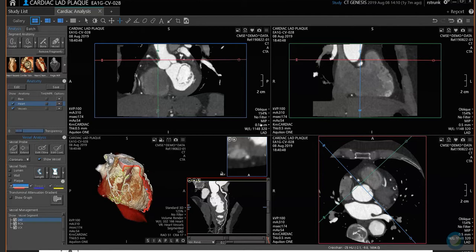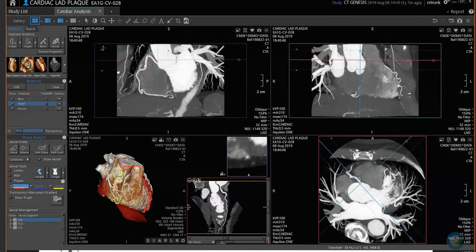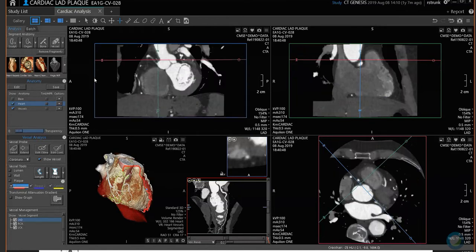If you really wanted to, you could click on the word that says 0.5 and type in a specific value like 10. But a lot of times you're just going to go real thick and then make it thin again for your diagnosis.